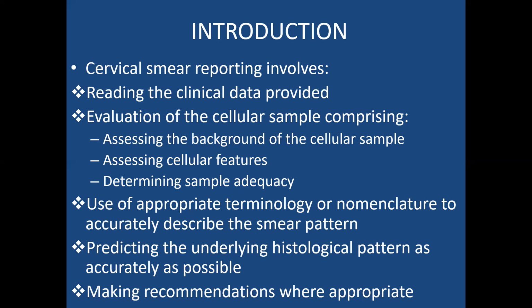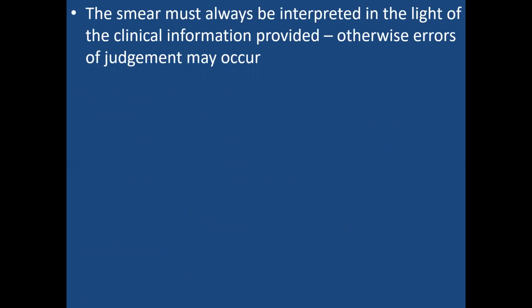But in writing the report, you're going to be using terminologies that are understood by both the laboratorians and the clinician. So today we are going to look at the terminologies that we use in reporting cervical smears. Remember, I said that the smear must always be interpreted in light of the clinical information provided. Otherwise, you're going to make an error of judgment.